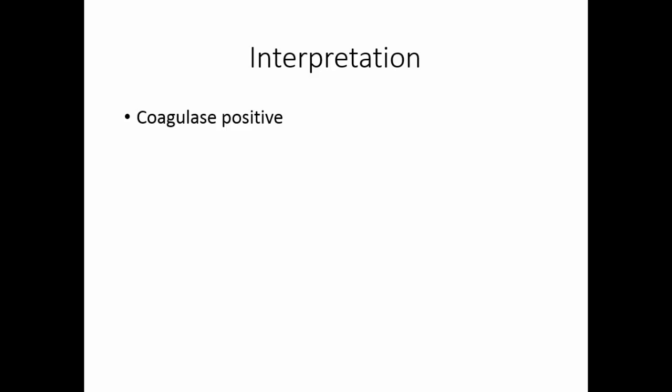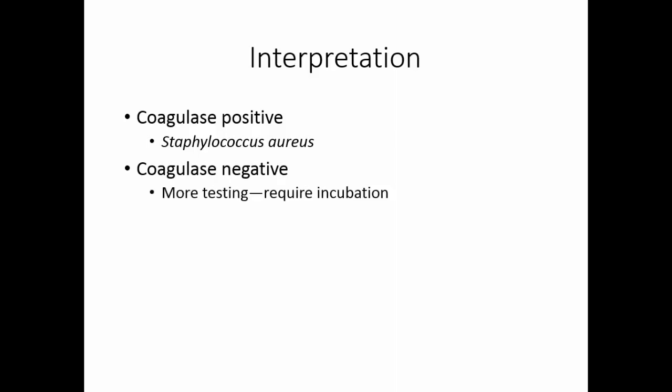If you have a coagulase positive organism, you have Staphylococcus aureus. But coagulase negative organisms will need more testing. These tests will require incubation. You will need to do the mannitol salt test and the novobiocin susceptibility.